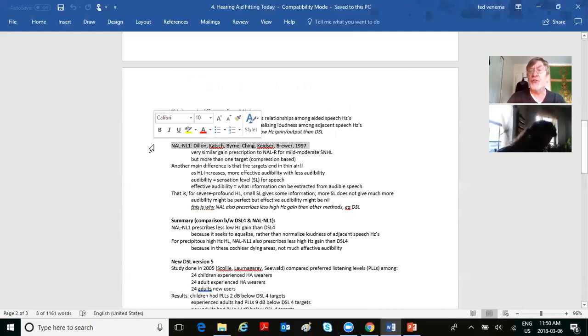The names to associate with NAL, the main one is Harvey Dillon. The other ones are all researchers along with Dillon. Thing to note to think about NAL-NL1 as well is this thing.